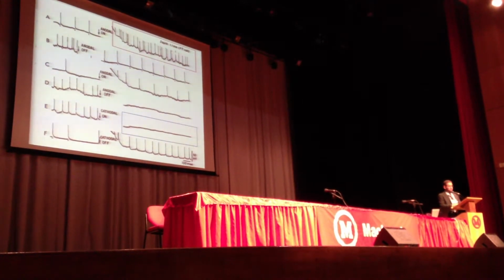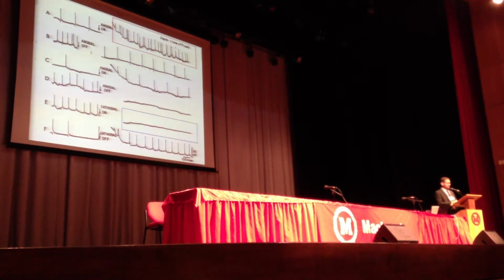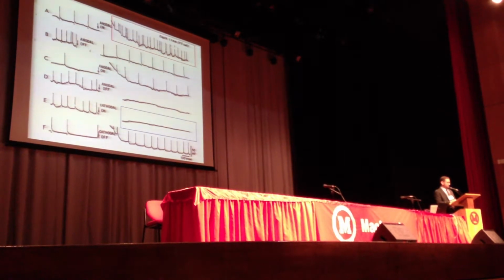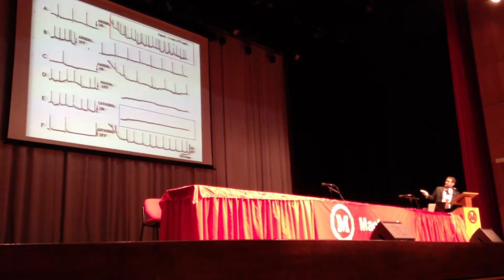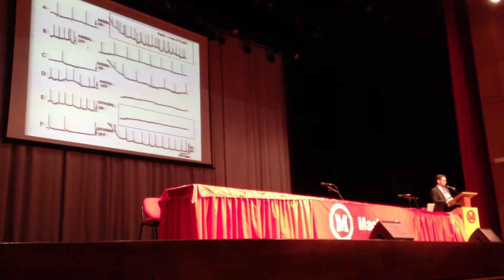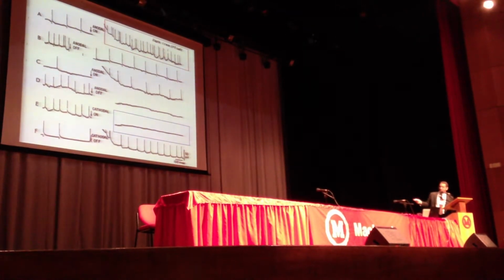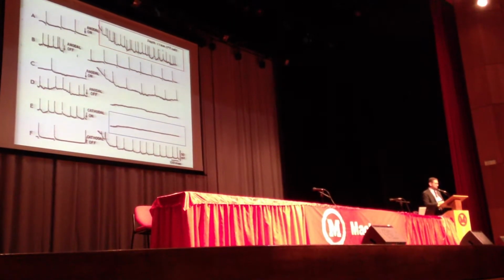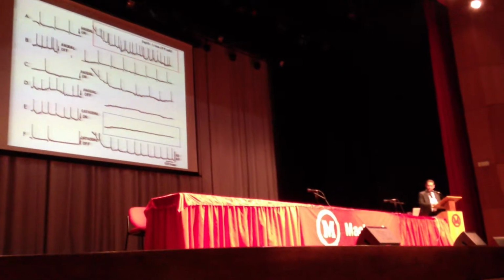The limitations would be, one, they're using stimulation that is 100 times stronger than what we use in tDCS. And I think they needed to use that to produce measurable firing rate changes. The second part of it is, how do we explain that this makes you read better or gives you less pain, right? It seems like a very generic claim. How do we explain that? Let's say this makes you read less well, right? Or makes you more creative in tool use, right? All these claims that have come out. There is a bit of a reach here.